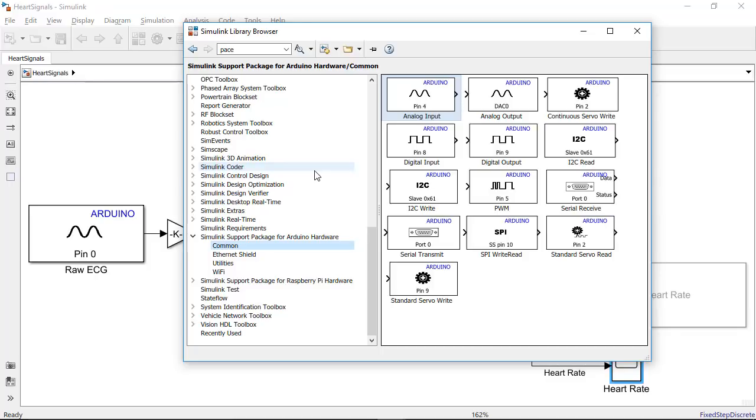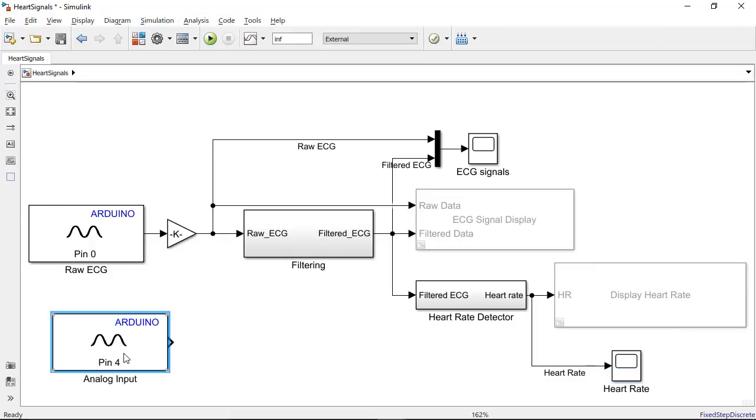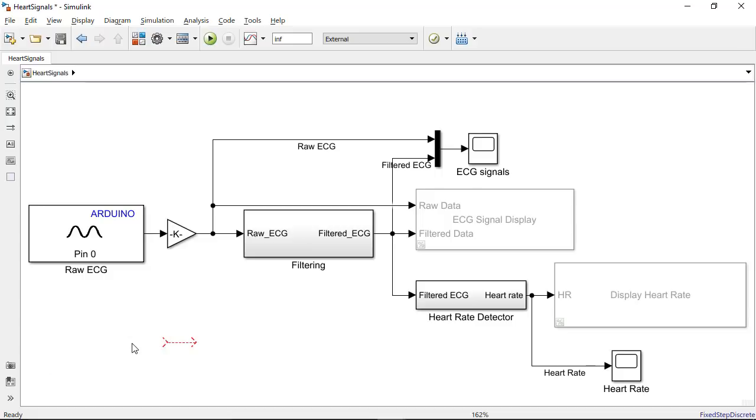So to build this whole model, I simply dragged and dropped different styles of blocks and changed some parameters here and there. The orange cable that we saw in the video is bringing in the ECG data as an analog signal to the Arduino at pin 0.